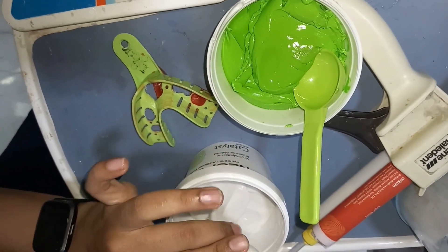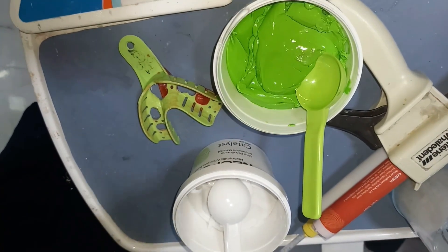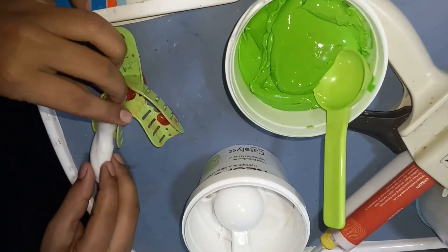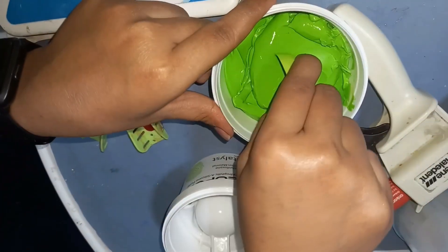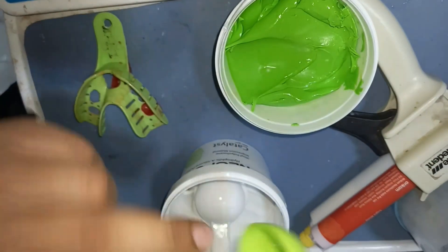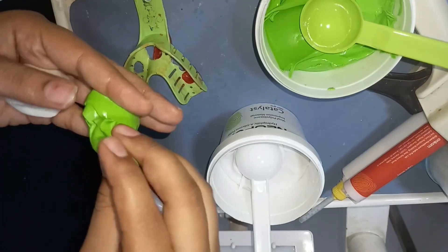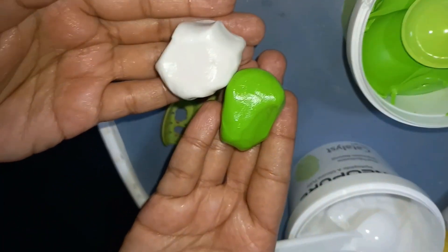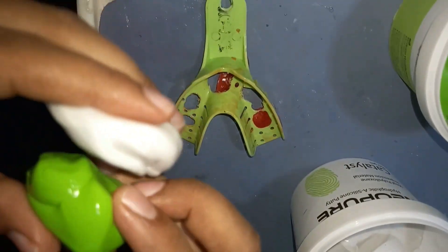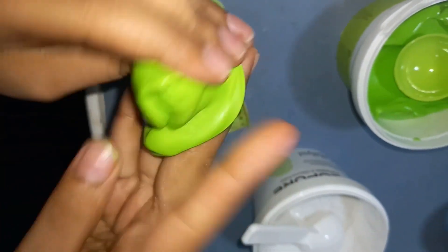Spoons are provided along with the container. With the help of the spoon, we take base paste and catalyst — equal volumes of each. Take the base paste with the green spoon and the catalyst with the white spoon. Then knead the base paste and catalyst with the fingertips for at least 30 seconds, as shown in the figure, and mix until the color becomes homogeneous.